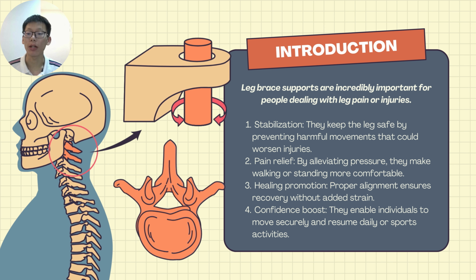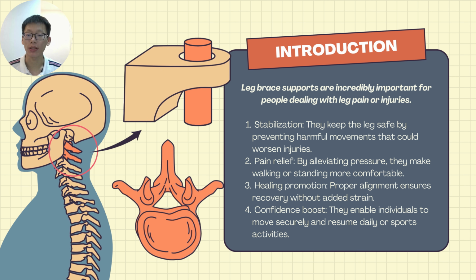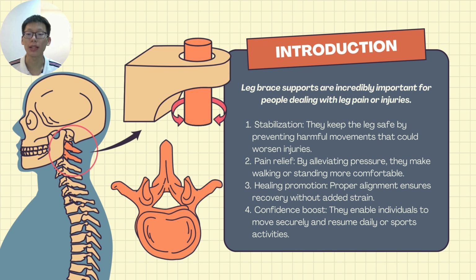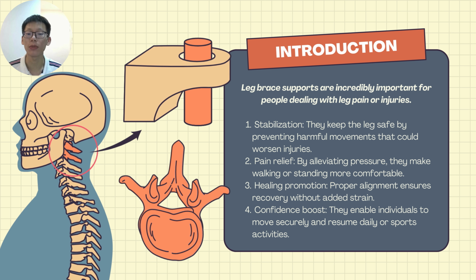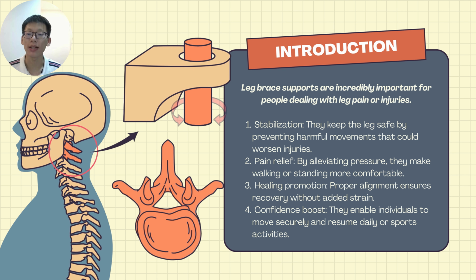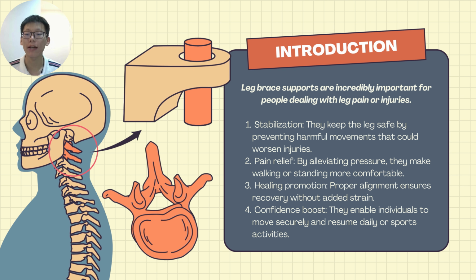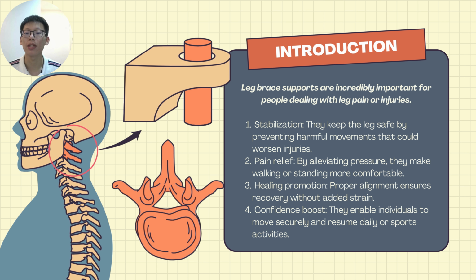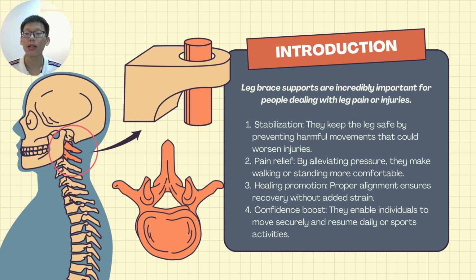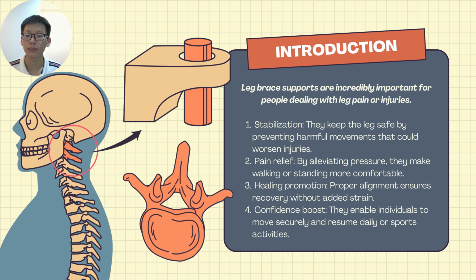Next, I will talk about the introduction of leg brace supports. So what are leg brace supports? Not everybody needs to use them. Just some people with leg injuries or surgeries need to use them. For example, a football player gets injured in a match, and after they do surgery such as ACL surgery, they will use the leg brace supports to prevent secondary injury.